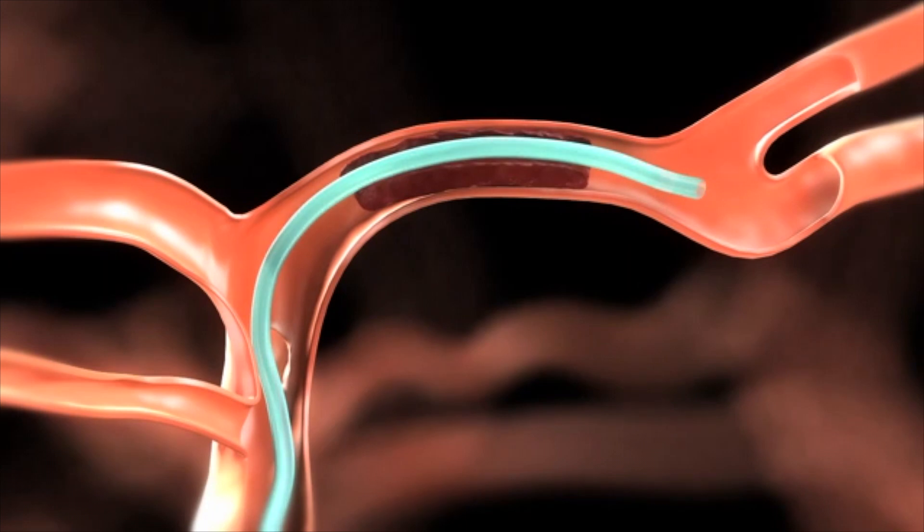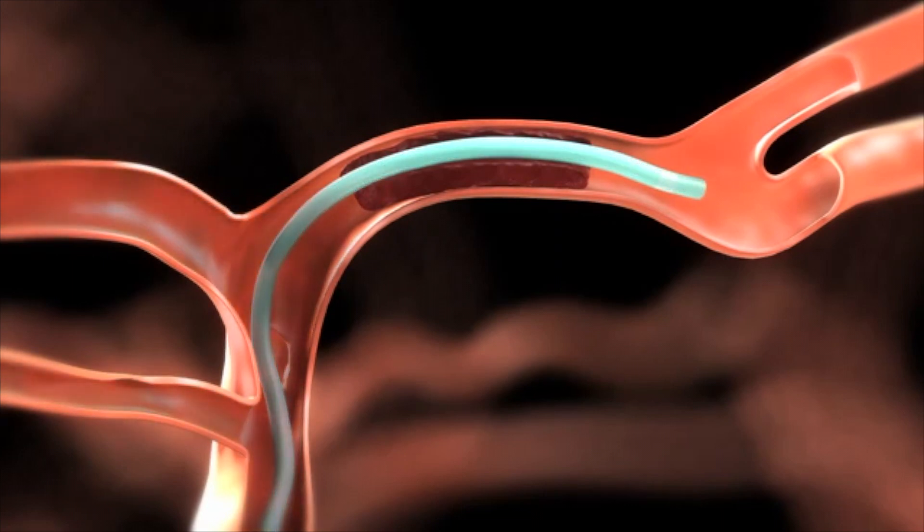With the aid of fluoroscopic imaging, carefully advance the solitaire FR until its distal markers line up at the end of the micro catheter. To deploy the solitaire FR, loosen the RHV, then carefully withdraw the micro catheter while holding the solitaire FR in place until the micro catheter tip covers only the proximal marker of the device.